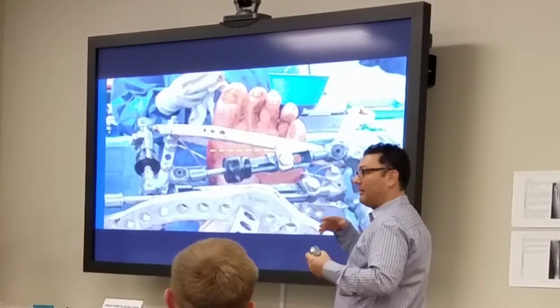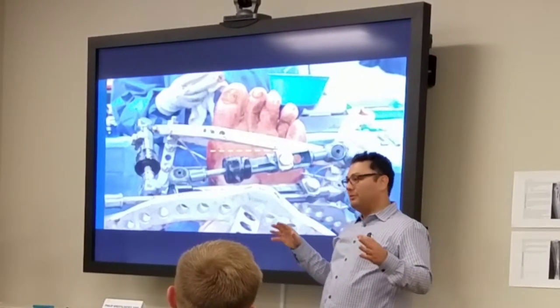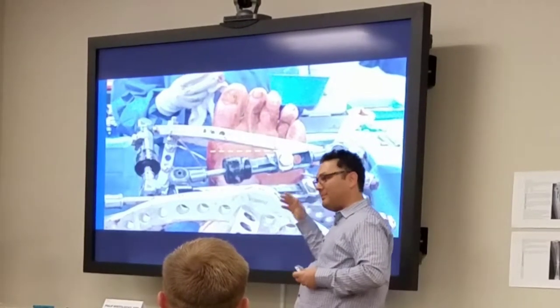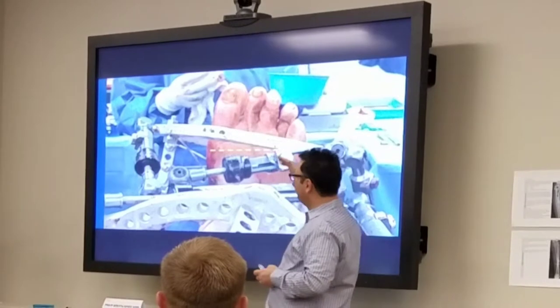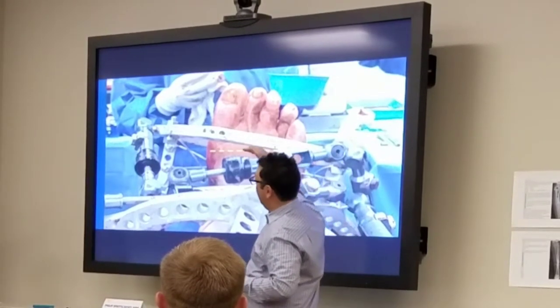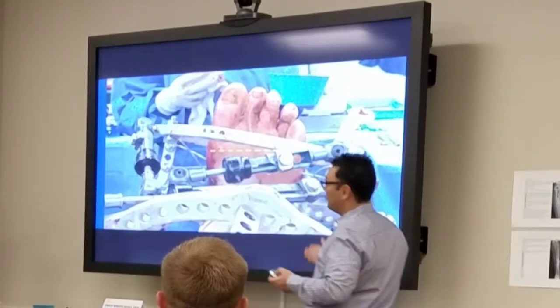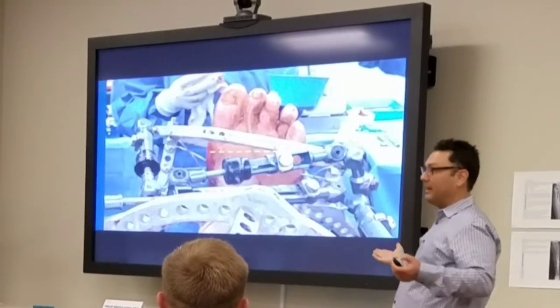This is great also because you hear these docs say you have to build it perfectly. No, build it so that it's stable and you get the osteotomy to work. This is what made it more stable. Now, it happens to be tilted medially forward by X amount of degrees, and we put that in the program. The computer will adjust for that.